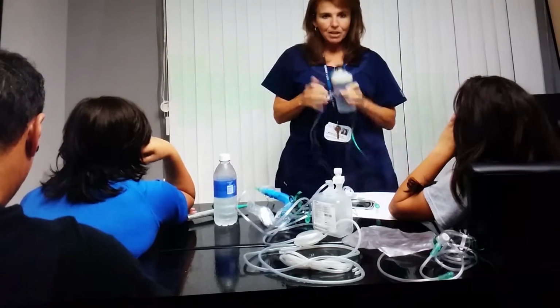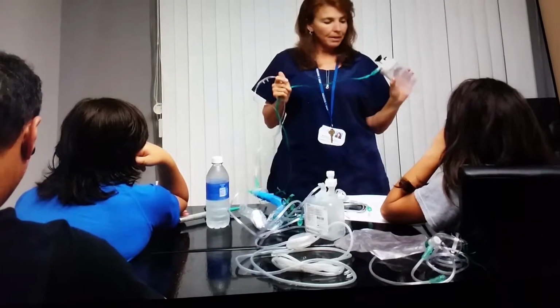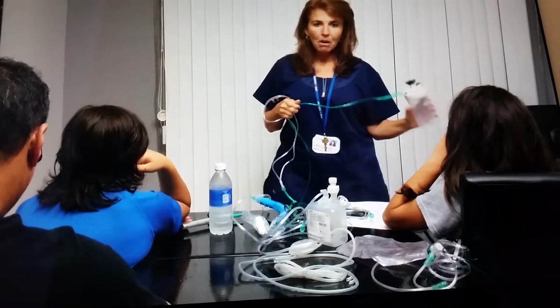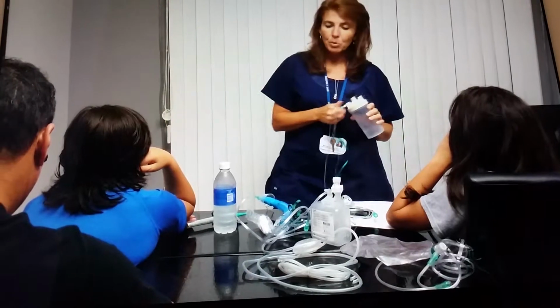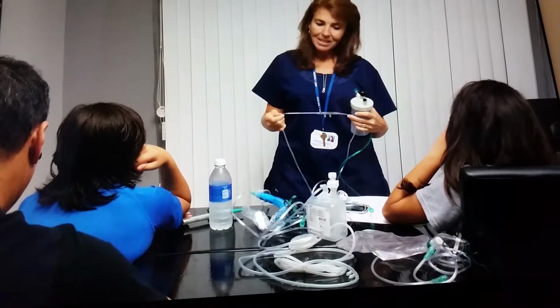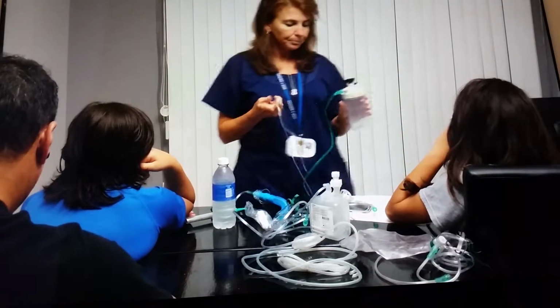The material is pretty pliable, so it's soft and comfortable for the patient to wear. The only disadvantage with this type of cannula is for transport. Because it requires humidity, you cannot connect this to our oxygen cylinders for transport. So at that point, you'd want to contact someone from respiratory therapy, and they can change the device type to either a non-rebreather or an oxymizer.